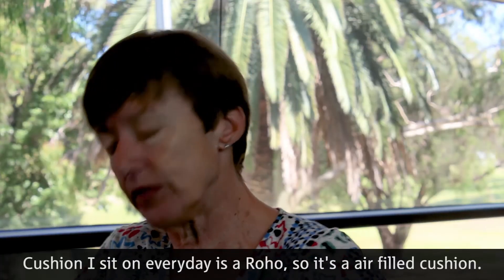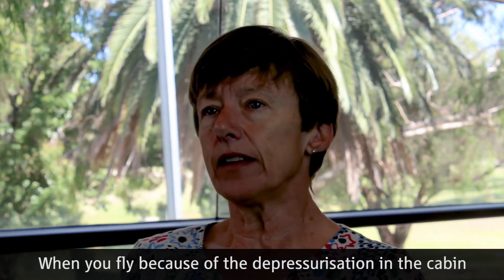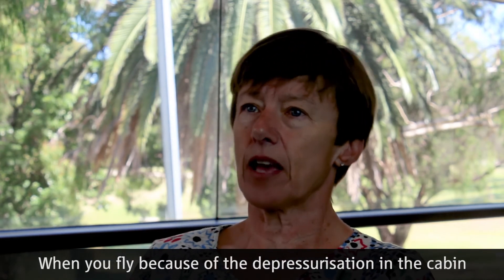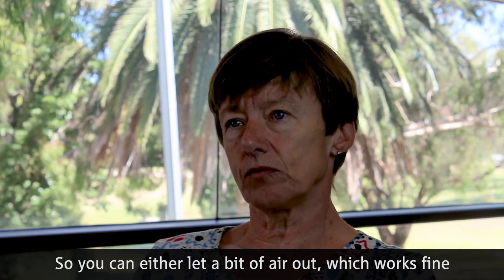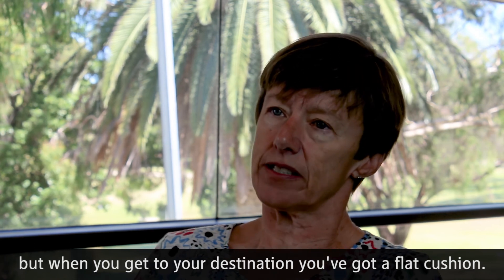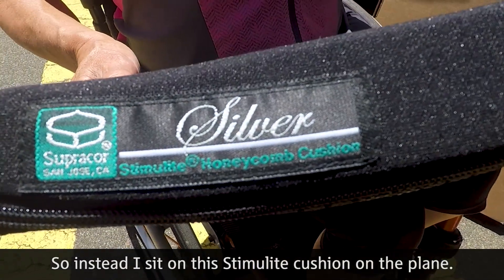The cushion I sit on every day is a Roho, so it's an air-filled cushion. When you fly, because of the depressurisation in the cabin, the cushion becomes really hard. You can let a bit of air out, but then when you arrive your cushion is flat, so instead I sit on this Stimulite cushion on the plane.